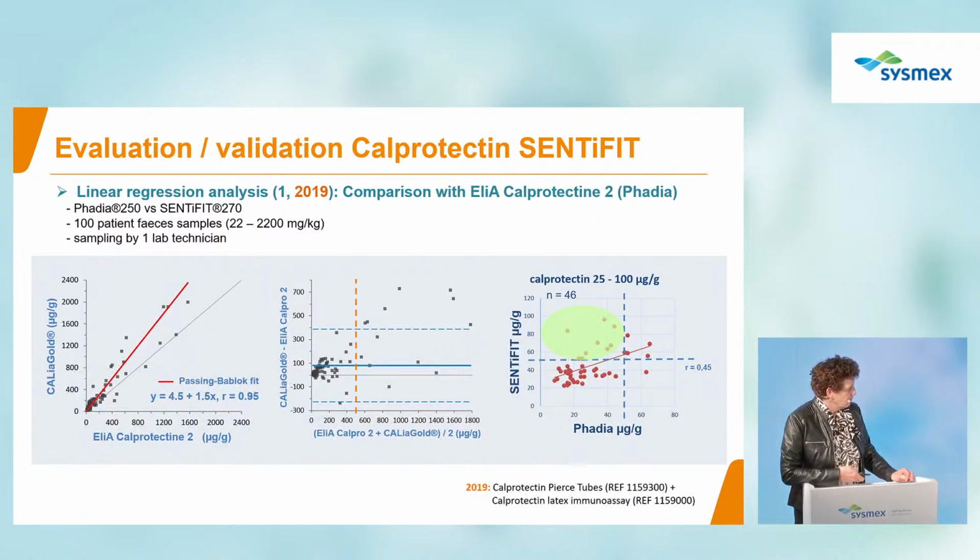What you see over here is that we tested 46 samples, and then we looked at the performance, and we said 9 samples were in an inconclusive range.